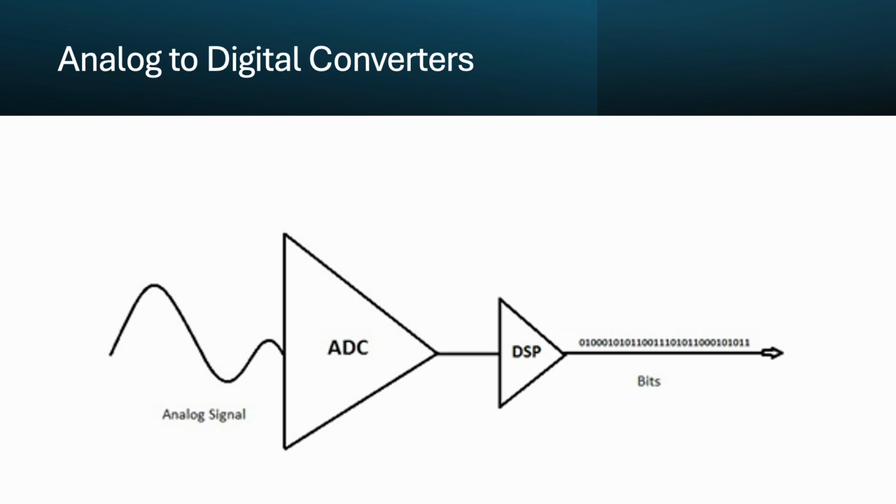This next statement is true for all recording, whether electrical recording or even musical recording. In order to properly reproduce the analog signal waveform, this sampling frequency needs to be at least 2 times higher than the highest frequency that is being measured.